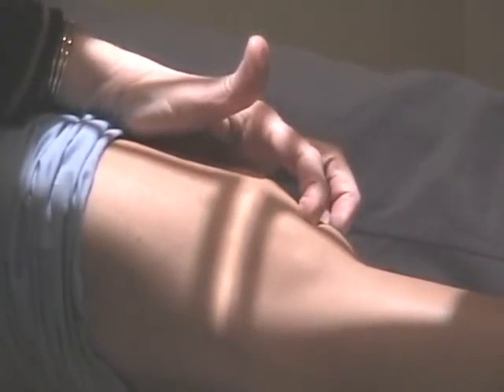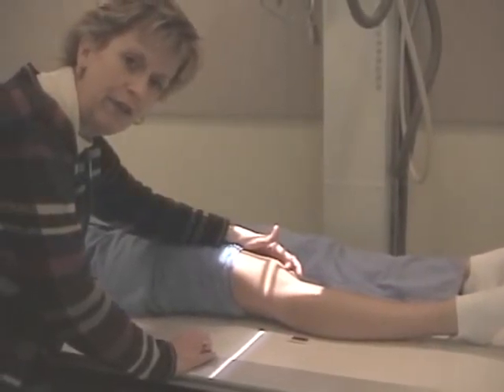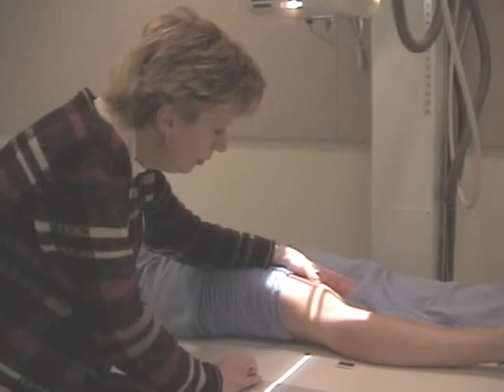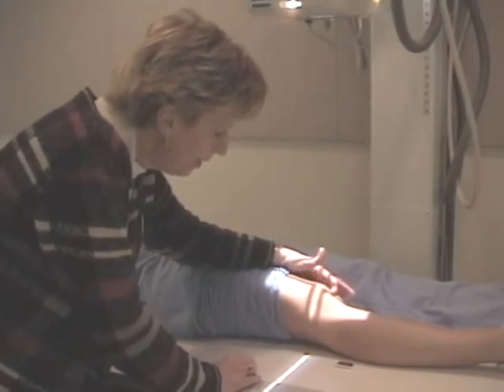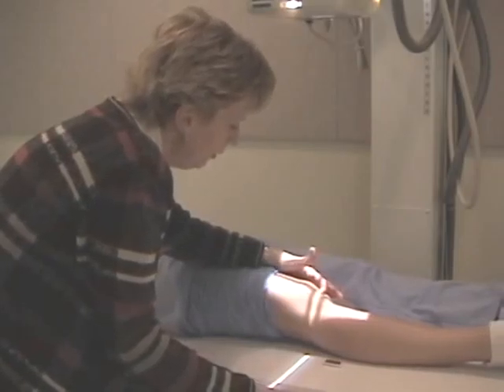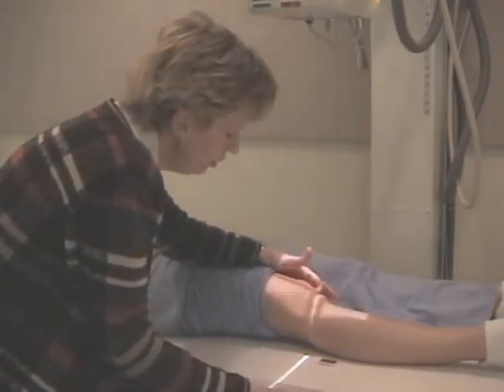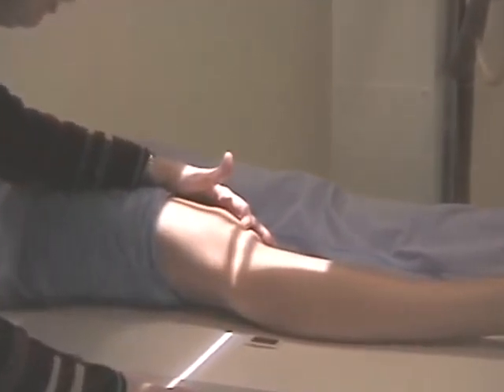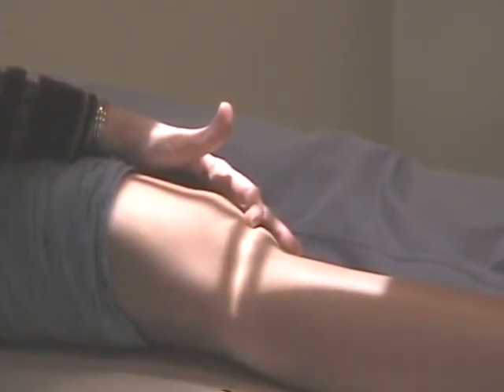Actually, relax your leg and feel for the apex of your patella and feel how it moves. This would be the base of the patella, the broad part. This is the apex or the point. And the vertical crosshair will enter 1/2 inch below the apex of the patella. That's where the actual knee joint is. 1/2 inch below the apex of the patella, to the center of the film.